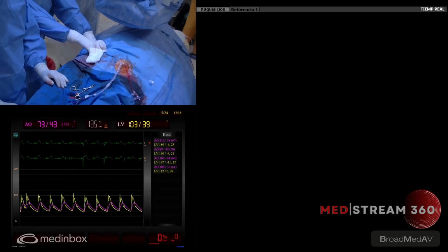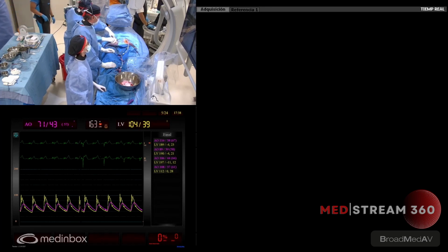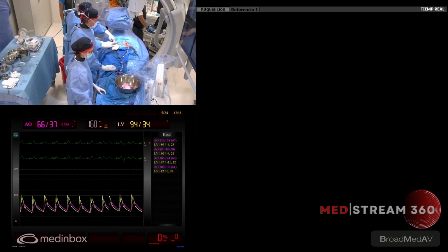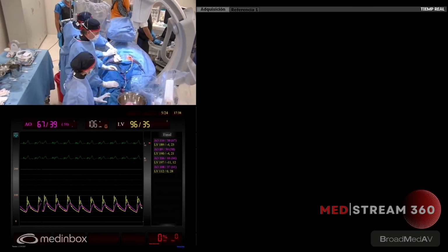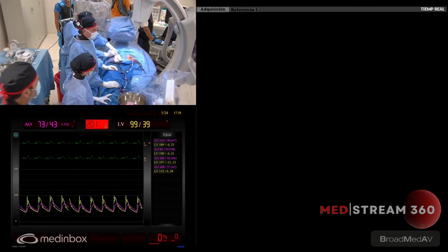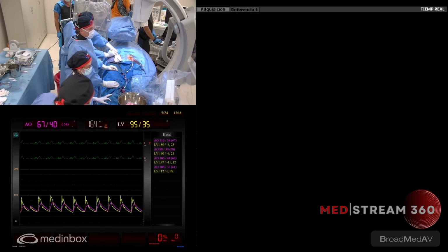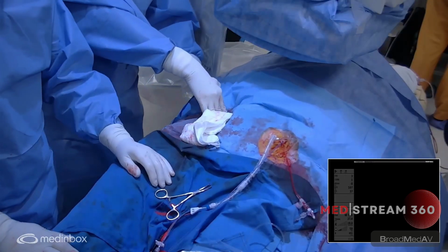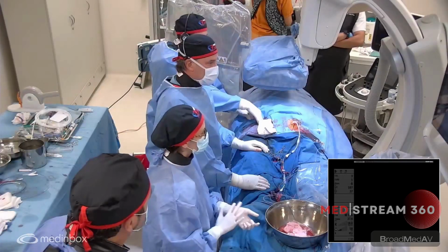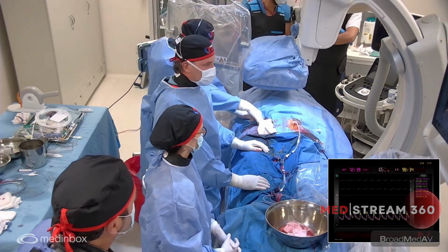We will test once more to be sure that we don't have any kind of bleeding. And then we will leave the wire in the right ventricle for pacing. And we will call our colleagues to keep this patient in mind and to decide probably tomorrow morning whether to put in the pacemaker, if this conduction disturbance does not disappear in the next 12 hours or something like this.